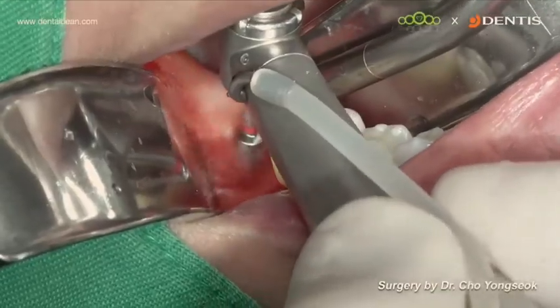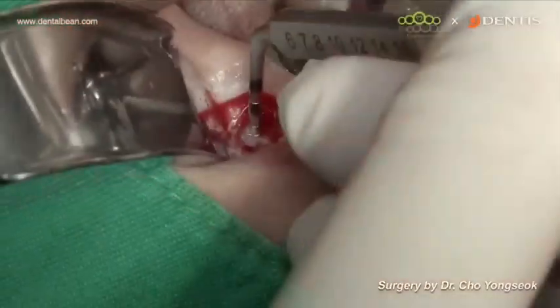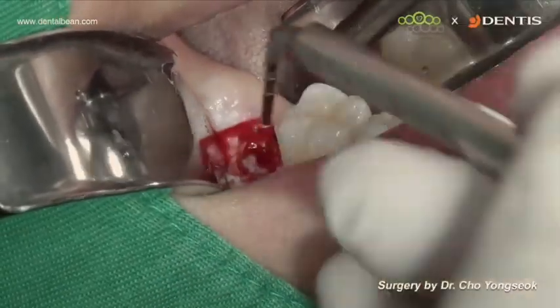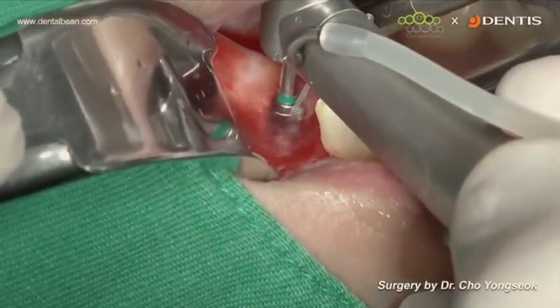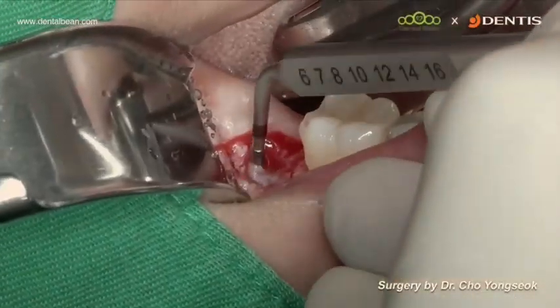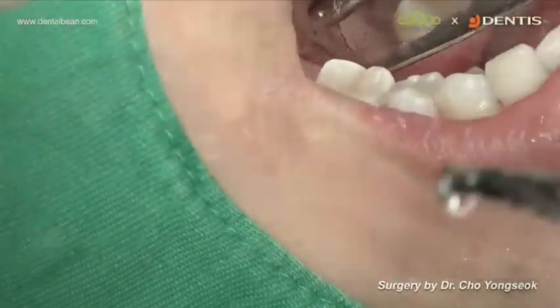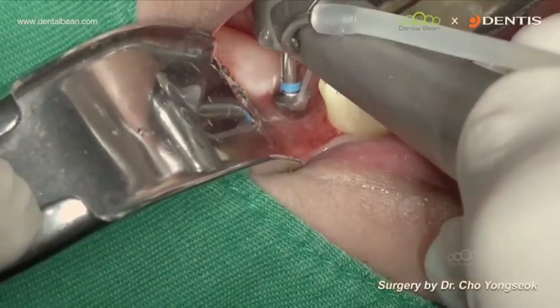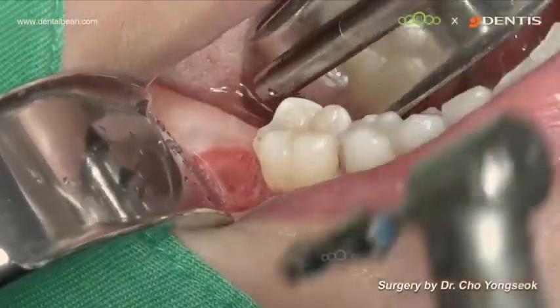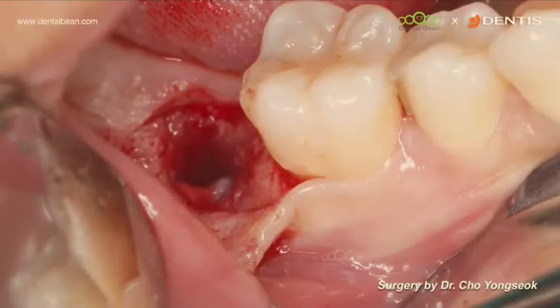Although it is not in a completely healed state, I prepped the osteotomy in the normal way. Apical bone is dense enough, so normal osteotomy was done. Increase the diameter of the drills, and intermittently check the depth and the condition of the hole with the depth gauge.